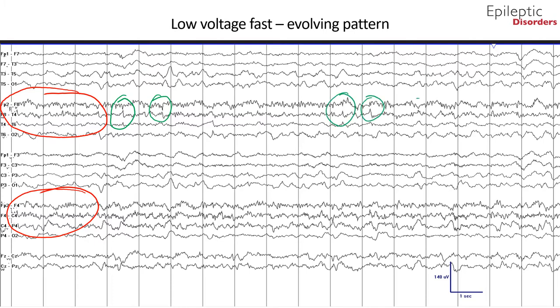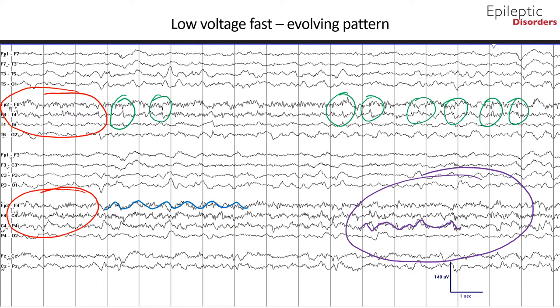However, towards the end they become more regular in their frequency. Also noted in this page is delta slowing that is greatest over the right frontal region compared to the contralateral left frontal area. In the last several seconds of the page, you can appreciate subtle spatiotemporal evolution outlined by the purple circle, where there is spread and increased higher-amplitude delta slowing over the C4-P4 region.